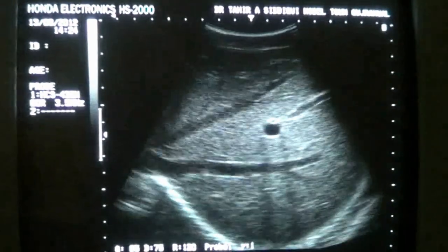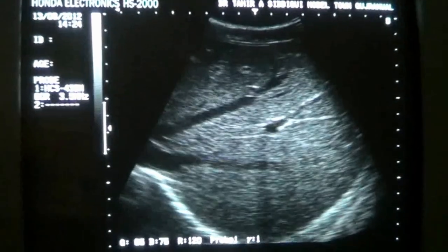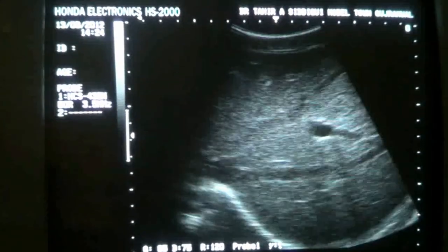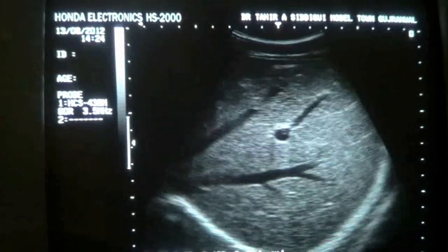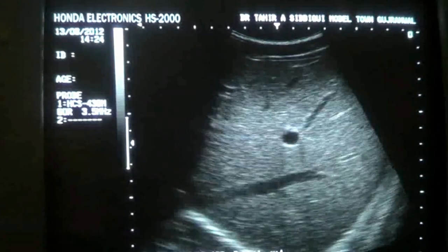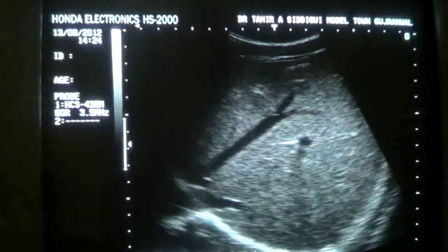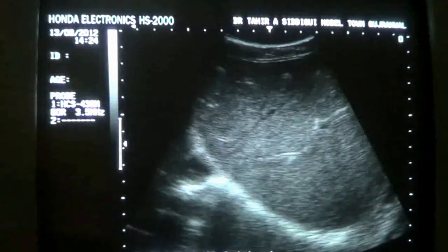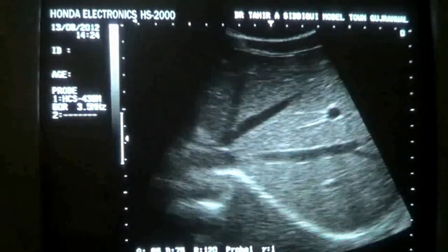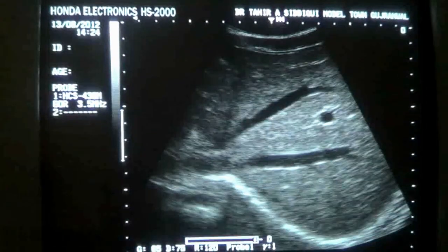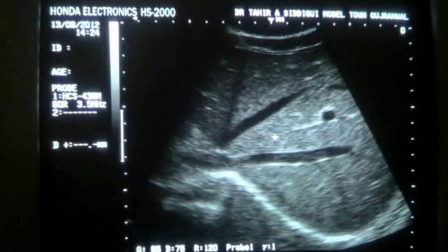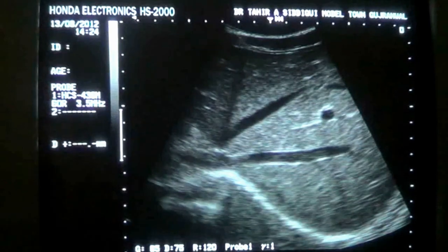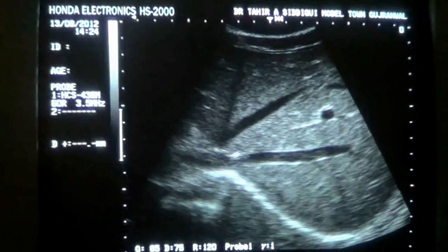This is a way of seeing the hepatic veins. Now come down a bit along the subcostal region and you will see the hepatic veins as well — all three: right hepatic, middle hepatic, and left hepatic vein.